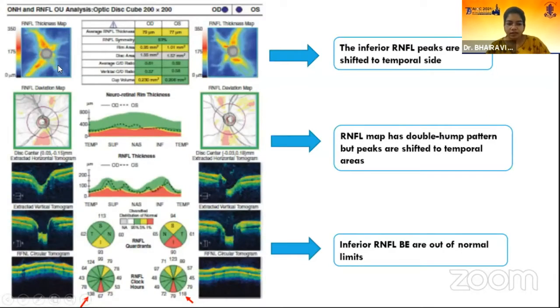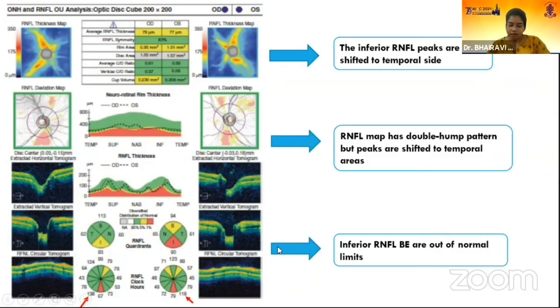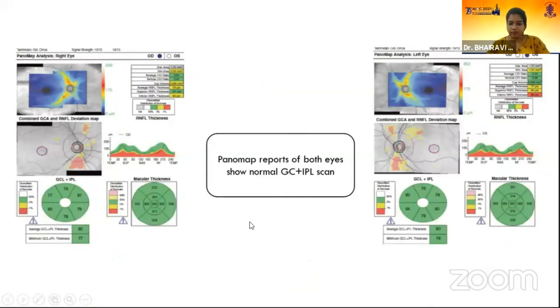In this report, we can see that the inferior bundles are shifted towards the temporal side. The RNFL map shows the double hump pattern but the peaks are shifted to the temporal areas. In the quadrant map, the inferior RNFL in both eyes is outside normal limits, but the temporal RNFL profile has increased thickness, so the RNFL profile is normal. The panel map analysis of both eyes shows a normal GCC profile.